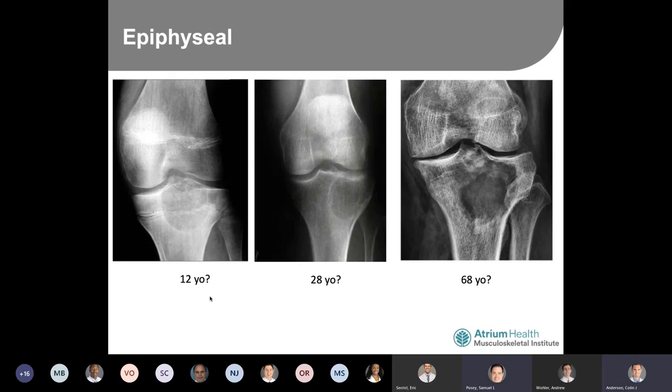Okay. And then, yeah, it is epiphyseal and also metaphyseal. I feel like just based on where it is, I was going to have enchondroma as one of mine, and then I'm kind of drawing a blank on some others currently. Can anybody else help out with our differential diagnosis of epiphyseal lesions?